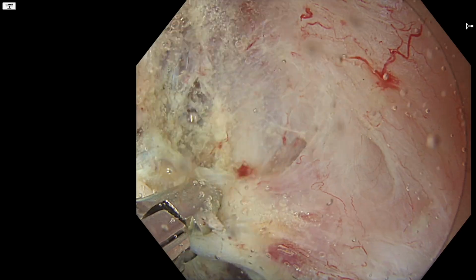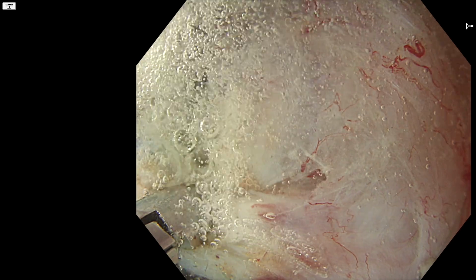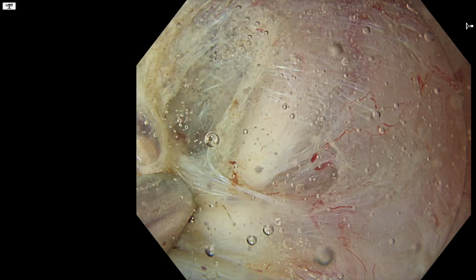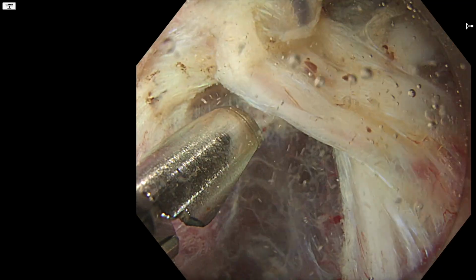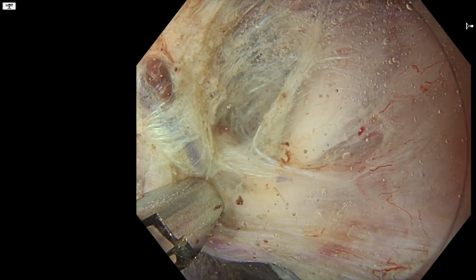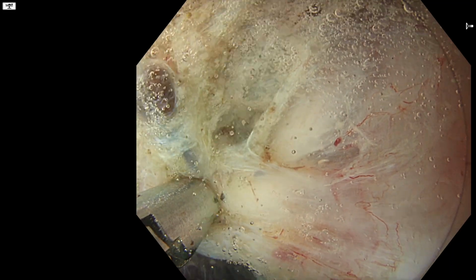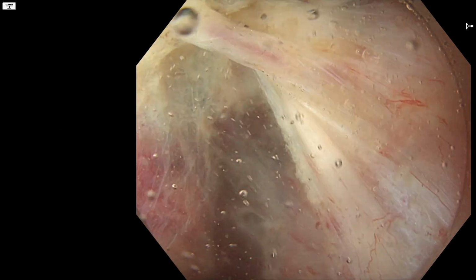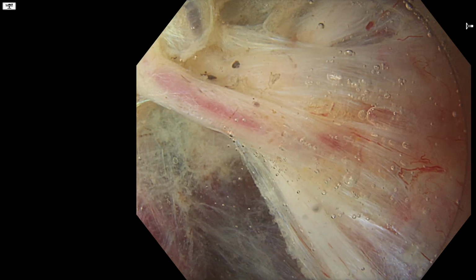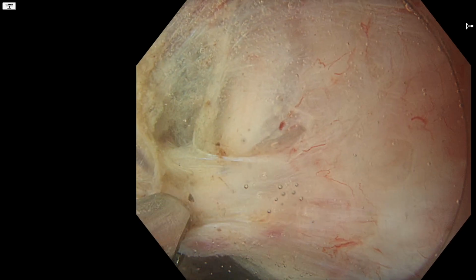So a lot of coagulation going on. Another tip I think is to isolate several vessels in one go. So have many of the larger ones isolated, so once you bring out the coag grasper, you can do them sequentially rather than having to isolate one, switch to the coag grasper, then back to the knife, then back to the coag grasper. I think it just speeds things up a little bit.